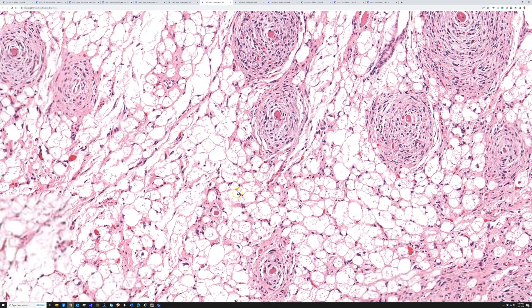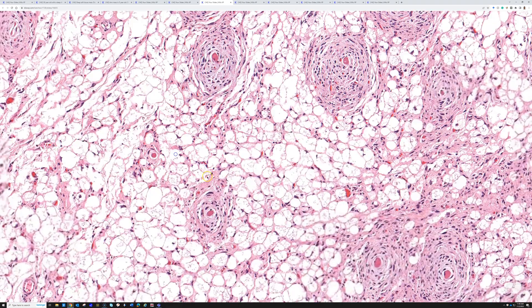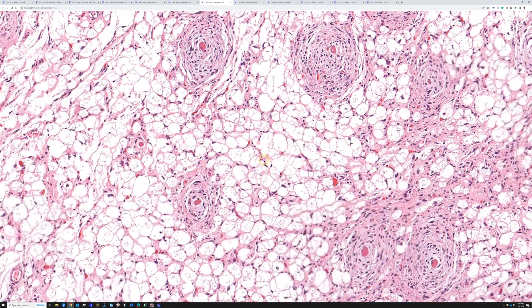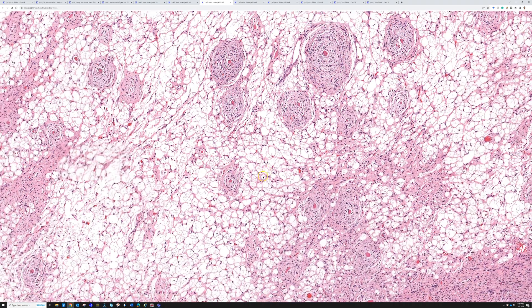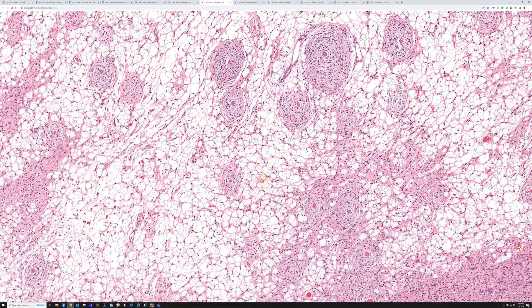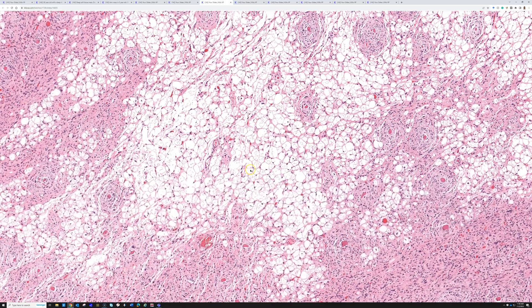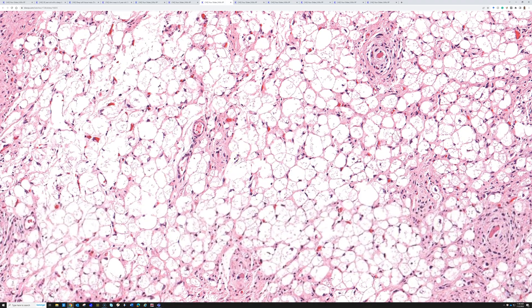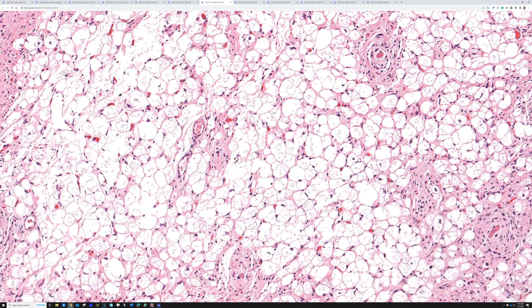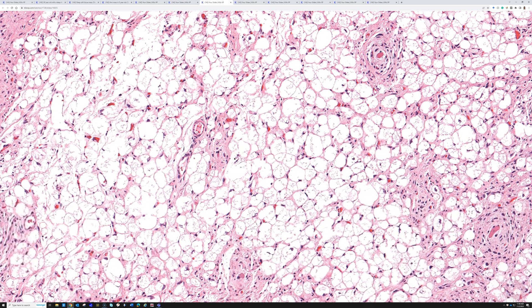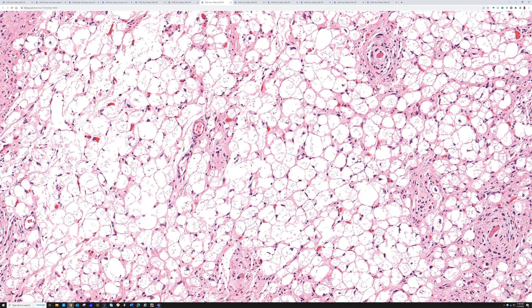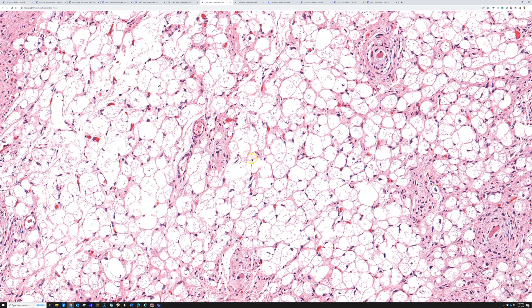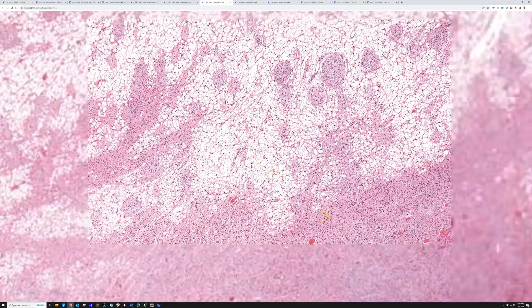And what's more, look at the background. For some reason, you get all of these bland, multivacuolated lipoblasts filling the background space, almost resembling the pattern of brown fat that you see in hibernoma. What a bizarre, crazy tumor with so many different patterns.